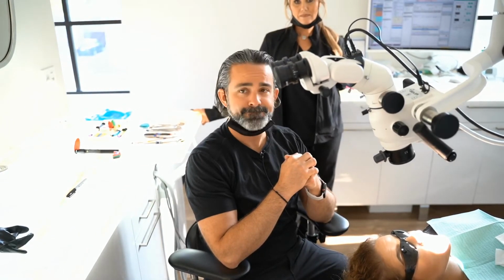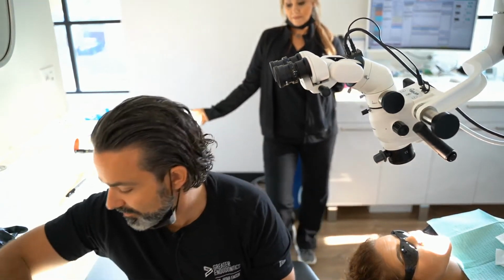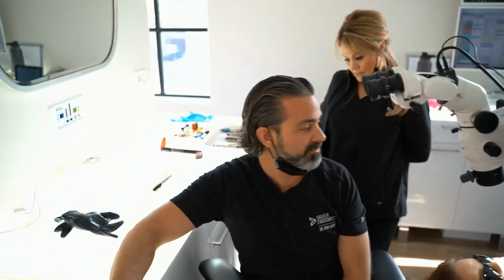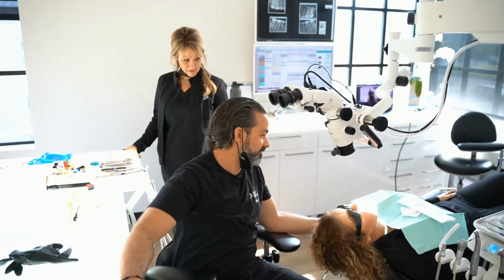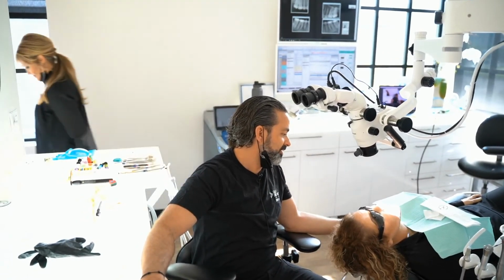What products are you using for cleaning the lenses? So there are, hey Linz, what's the cleaning wipes from the... Look on my phone, I have a picture. Kimtech. One thing that I really like, and you can get it through Patterson, Shine, Burkhart's, whoever your suppliers are, is Kimtech. They're wipes you use in a chemistry lab. They're really fine, single use, and you just wipe them and throw them away.